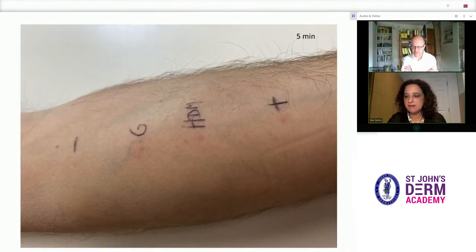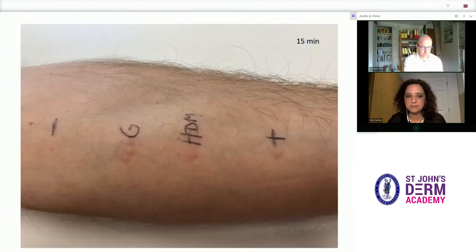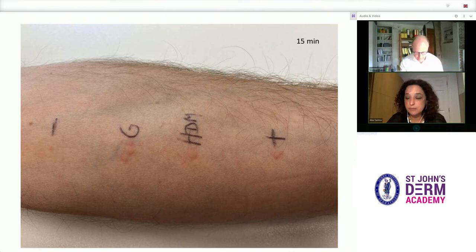This is Karsten's arm five minutes later, showing some early wheals developing, increasing in size gradually — here seen around the 10-minute mark. Here we are at 15 minutes, and the results can be read now.